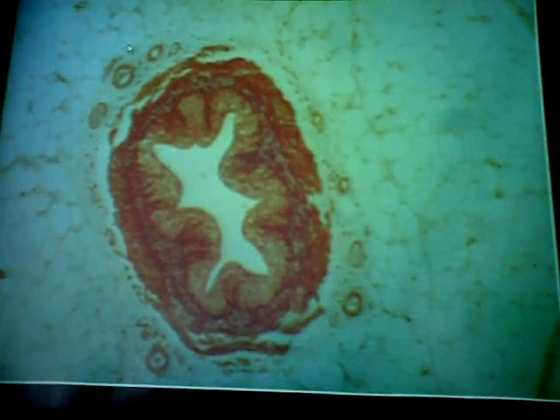On this you can follow along on your lab objective sheet on page 13. If you look under ureter, toward the top of the page under processes involved in urine formation, everybody see that? The epithelium, the first thing listed there, is transitional epithelium. What do we mean by transitional? A change. It means the cells change shape according to the amount of pressure put on the organ wall. In this case there's no pressure because it's empty.